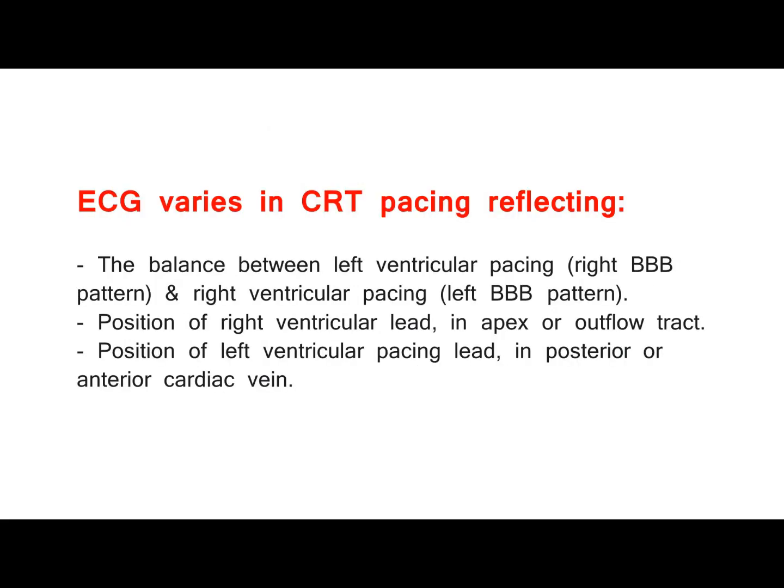ECG varies in CRT pacing reflecting the balance between left ventricular pacing, right BBB pattern, and right ventricular pacing, left BBB pattern. Position of right ventricular lead in apex or outflow tract. Position of left ventricular pacing lead in posterior or anterior cardiac vein.